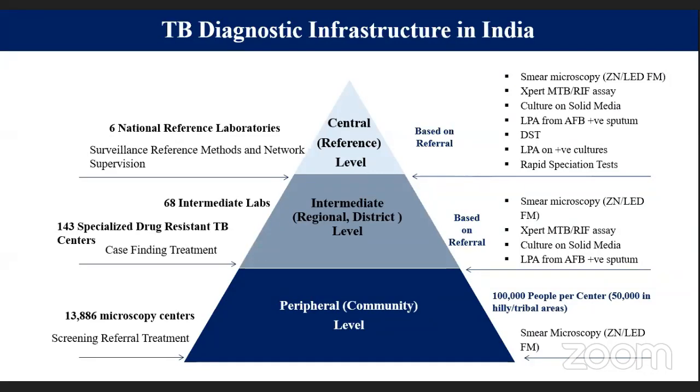A patient goes to the peripheral community level centers and gives their sputum sample. A healthcare worker takes out the sputum, makes a smear on a glass slide as per the WHO guideline, and that glass slide is observed in a bright field microscope.